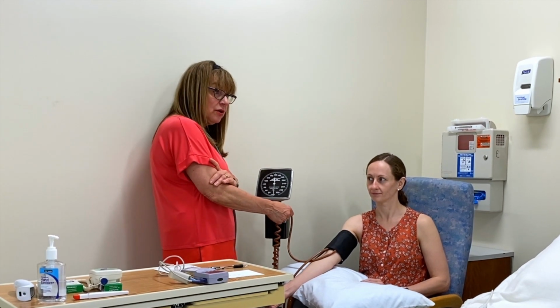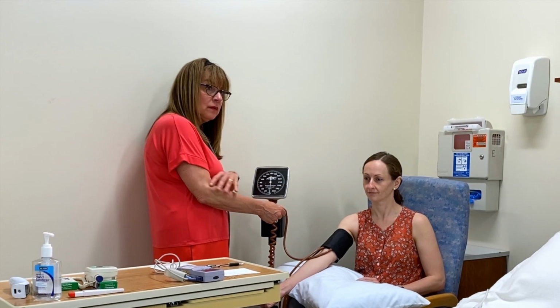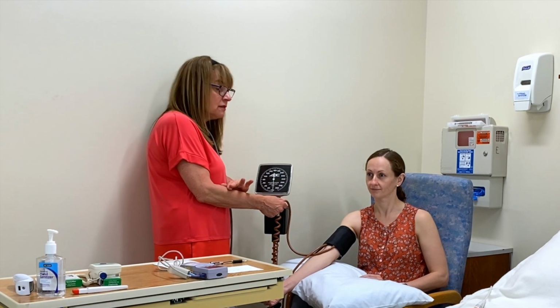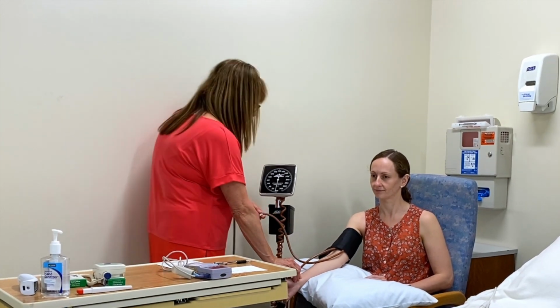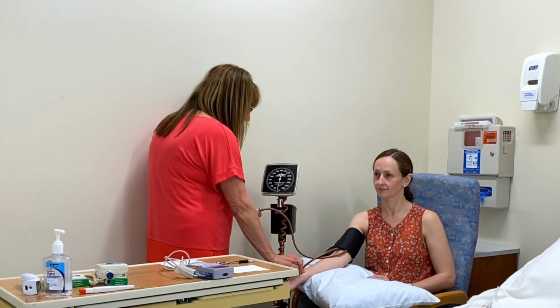Because remember, this is like a tourniquet. You're inflating it to obliterate all sound, so you hear the systolic, the first reading, and then the last sound is diastolic. So I'm going to palpate first. So I'm going to palpate her radial pulse, and I'm going to watch the monitor here. I'm going to inflate the cuff.